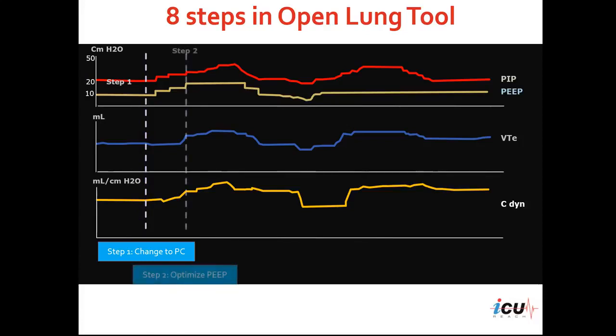The second step is to optimize the PEEP by going gradually with 2 to 5 centimeters of water each time to reach the PEEP level of 20 centimeters of water. You can see the increase in peak inspiratory pressure proportionally to the increase in PEEP.